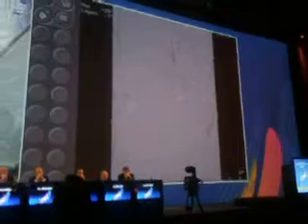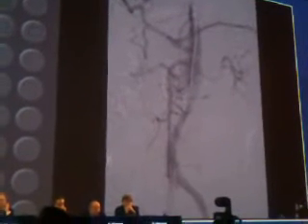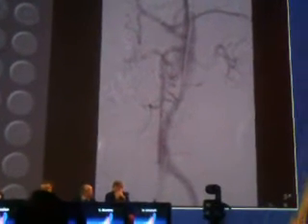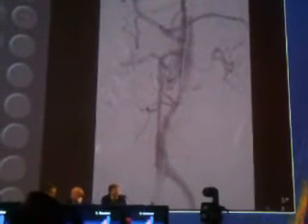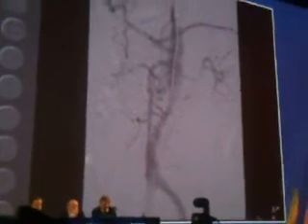So first we went up here with our pigtail catheter. Just a moment, where is it? Yeah. So what we do to really find the true lumen is take a pigtail catheter, so we don't take the wire tip upwards, which can rather easily also go into the false lumen. So we push the pigtail up, let's say with the loop, until we reach the distal artery. We give a shot, and here we can see that we are in the true lumen. We know from the CT that all distal arteries here come from the true lumen, and then we continue to push the pigtail up without wire.